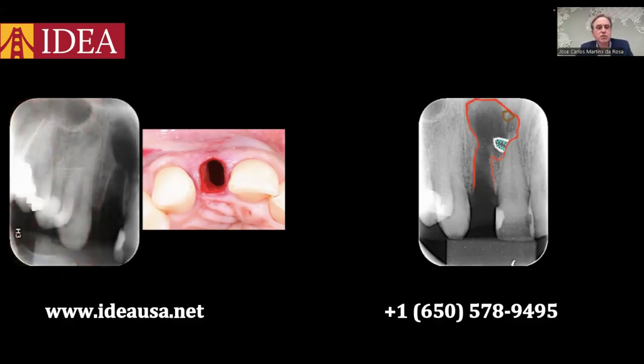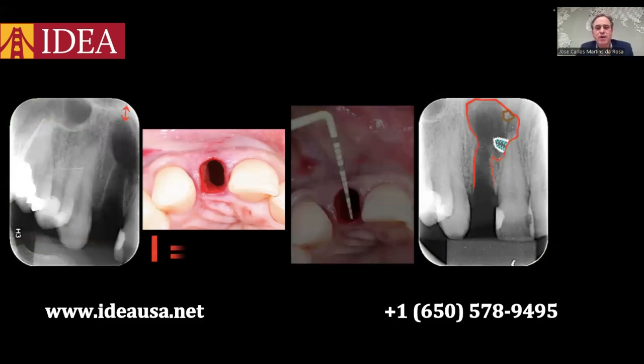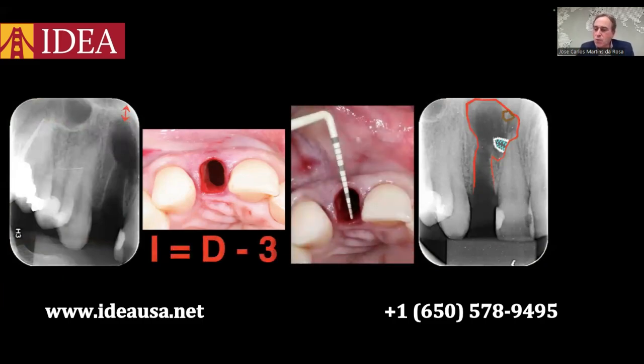And just keep in mind that we have very tiny bone at the apex. How to stabilize an implant right now? We use this very simple mathematical rule to select the correct implant diameter. Here, as we have 6 millimeters of buccal-palatal distance of the socket, the implant diameter should be narrow, around 3 millimeters in diameter.